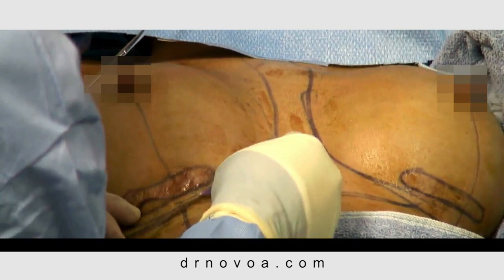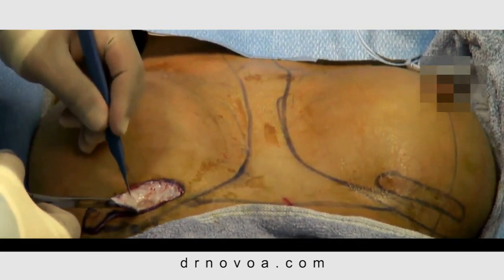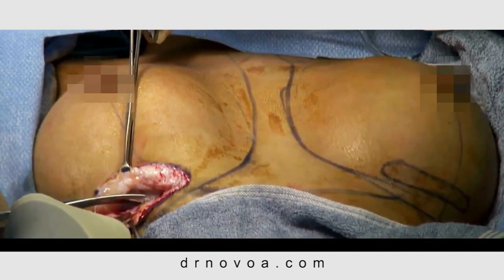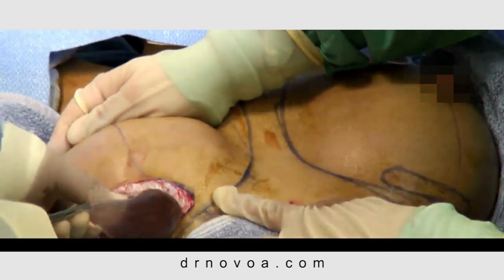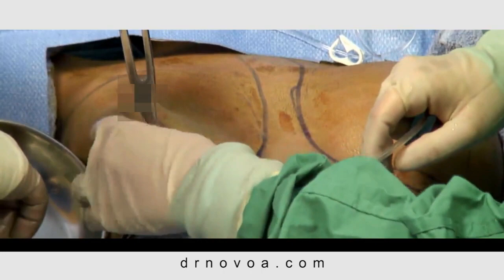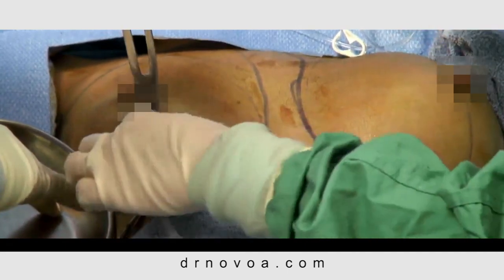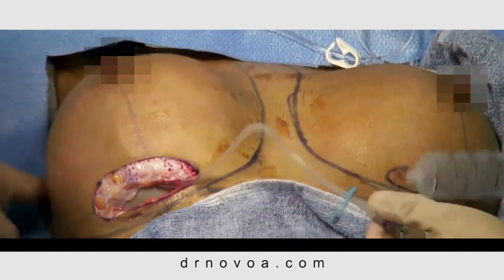Area 2 is infiltrated up to the nipple areolar complex and the scar is removed. Sharp dissection continues to the implant pocket. The implant is then removed. An implant sizer is placed in the pocket and inflated to determine the pocket boundaries. A relaxation of the pocket beyond the anterior axillary line is found.